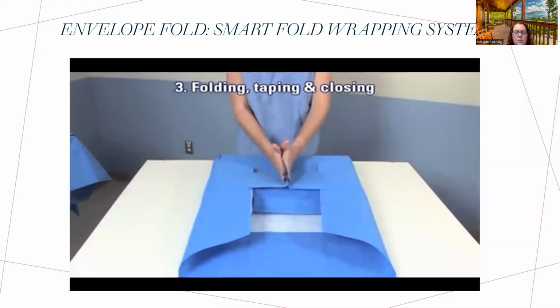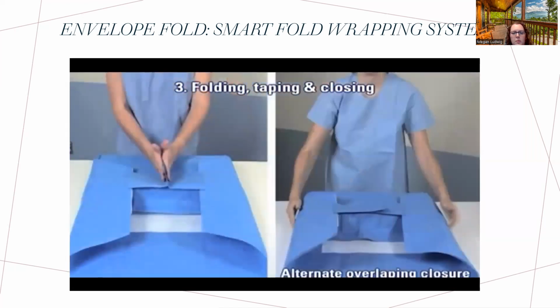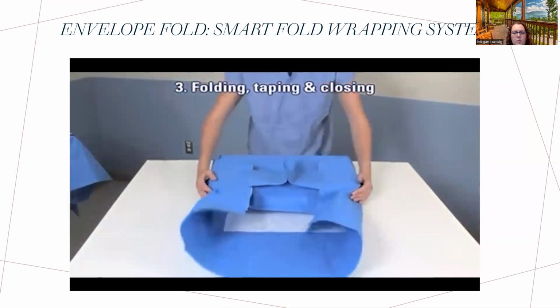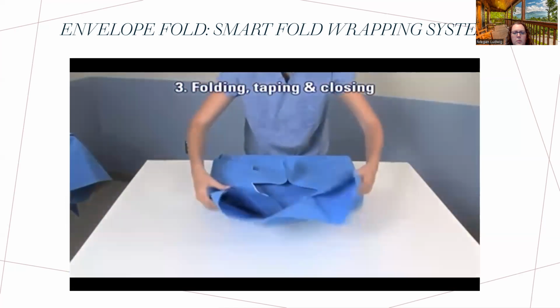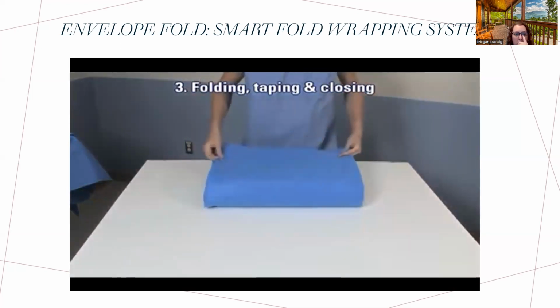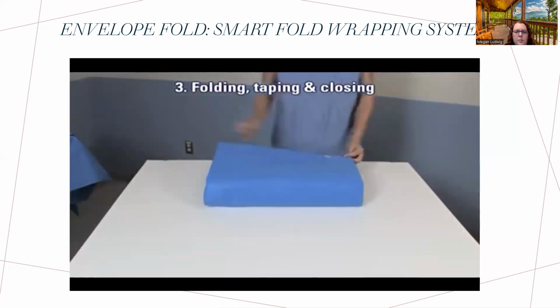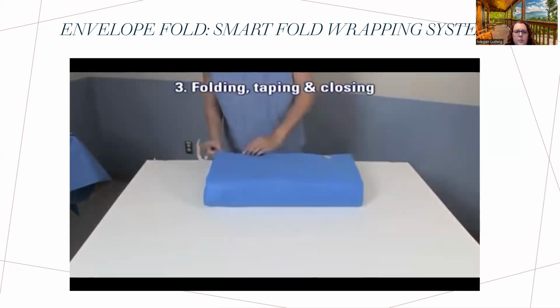Bring the outer ends of the flaps together, like this, or overlapping. SmartFold's ergonomic design features keep the fabric in place without elbows or awkward bending and twisting. Now, tucking the front corners slightly, reach over and pull the blue section up across the top of the tray. Note that the top section is less bulky for a nice, neat closure while still providing a full 3 layers of protection to the tray. Tuck the front end under, neaten the edges, and tape with indicator tape as usual.